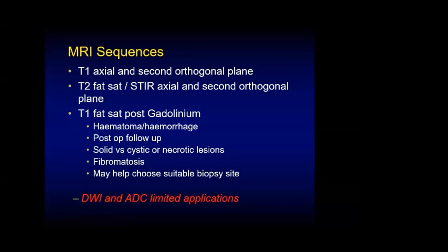Not all centers will give gadolinium liberally for all soft tissue tumors, but I have identified certain indications for giving gadolinium, and these include, for example, distinguishing tumor from hematoma, and patients who have had surgery and came back for follow-up. You always give them gadolinium because then you distinguish between tumor recurrence versus post-surgical scarring and fibrosis.